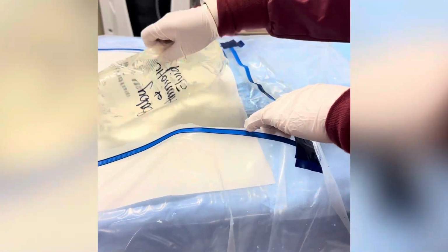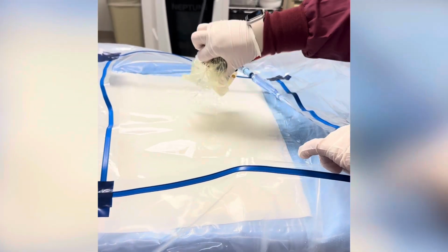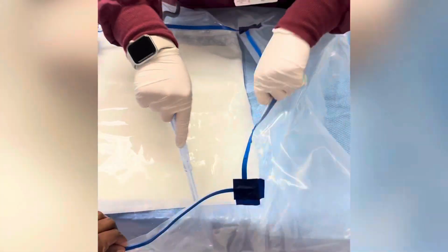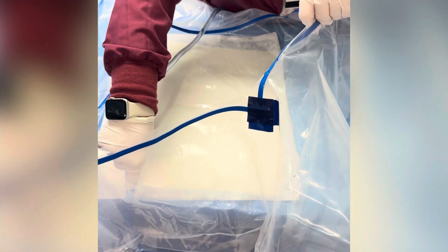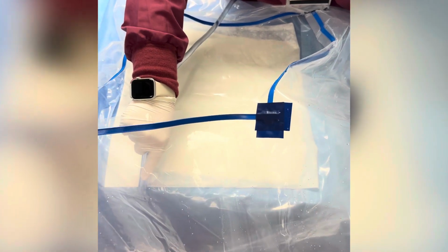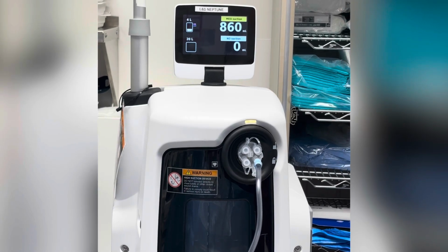It's baby time! After the membranes are ruptured and baby is delivered, the surgical tech begins suctioning up as much amniotic fluid as possible. Once the amniotic fluid has been suctioned, take a look at your Neptune and write down the new canister volume. That is the amount of amniotic fluid, and it is important as it will go toward your subtracted fluid amount.